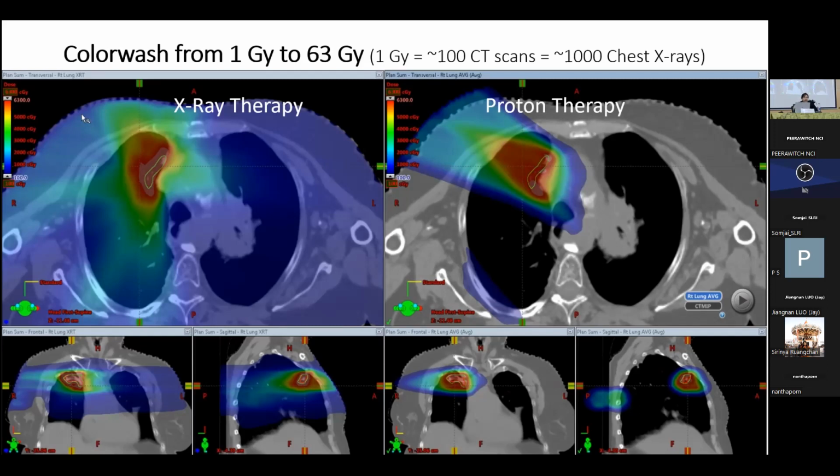So you can see traditional x-ray therapy, you get all that radiation. Now, is 2 or 3 gray here, can we actually measure acutely what's going to happen? No, but particularly as was shown earlier, we're now saying proton therapy, maybe even for anybody under age of, for sure, 21, or as was shown, maybe under age of 36, maybe under age of 45, or by life expectancy. You cure this, and maybe you're 40 or 50 years old, you may still live another 30, 40 years. So what is this radiation, all these extra doses, doing to the rest of your body? So just an example to help put in context why we want to do proton or particle therapy.